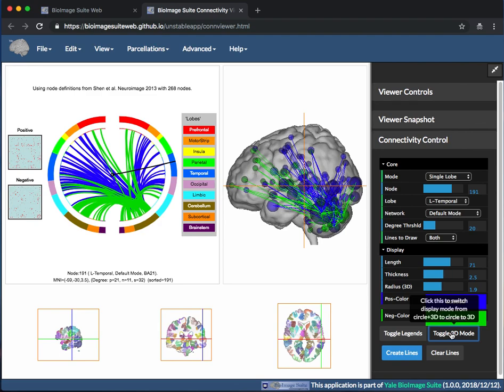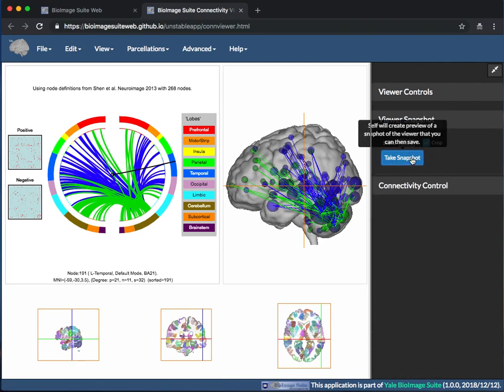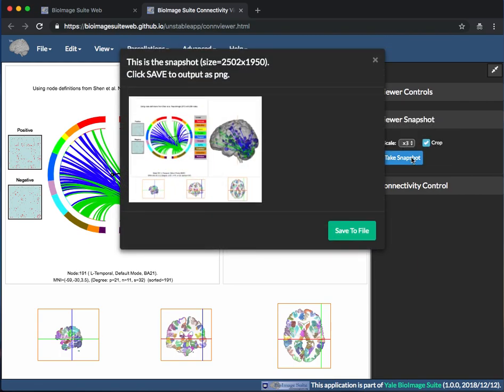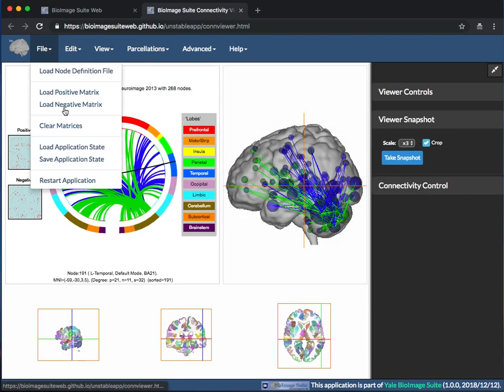Finally, when you're done making your image, you can save it in a couple of ways. For a static image, you can go to Viewer Snapshot and take a snapshot. To make a live figure that you can come back to later in the Viewer, select Save Application States.